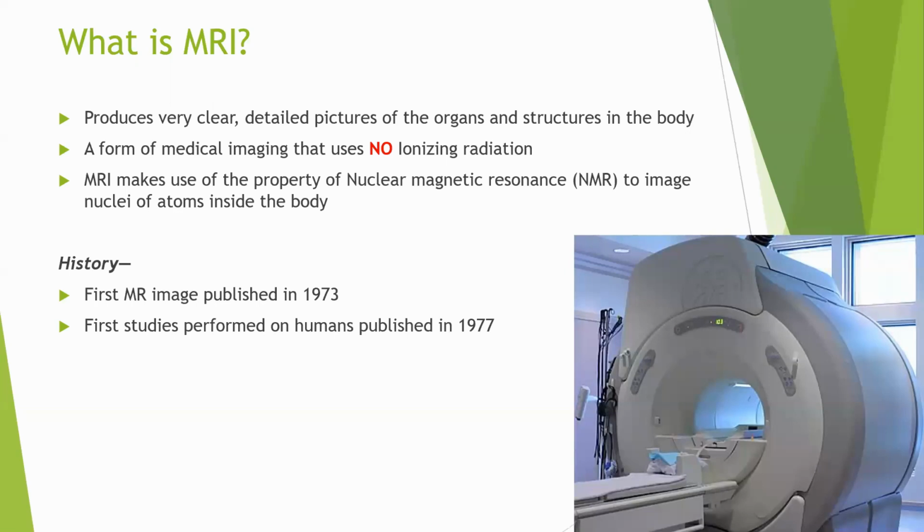I will tell you a story, picking key bullet points from the slide, and try to help you understand what MRI is. So what is important to know from MRI? The relationship between structures, the structural differentiation between a nerve or a disc, or a tendon versus a ligament versus soft tissue and a bone. How they are different is what you want to look at in an MRI.